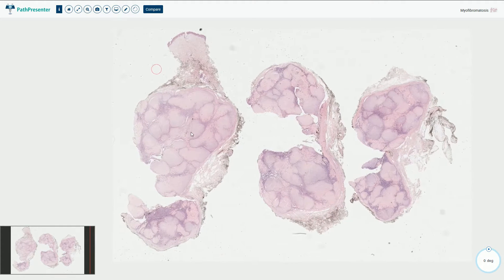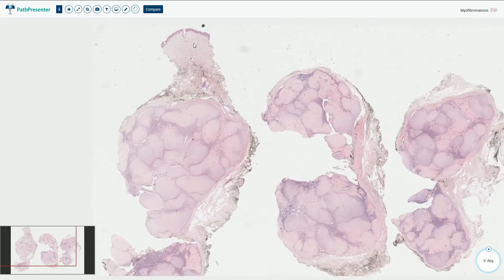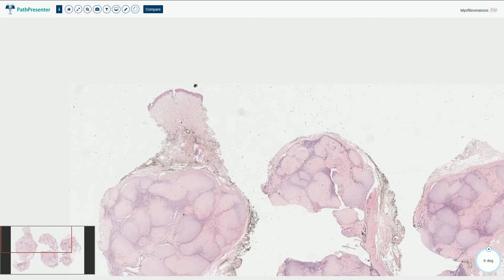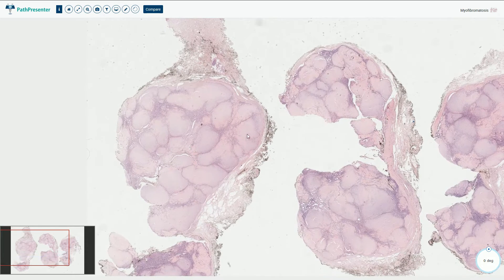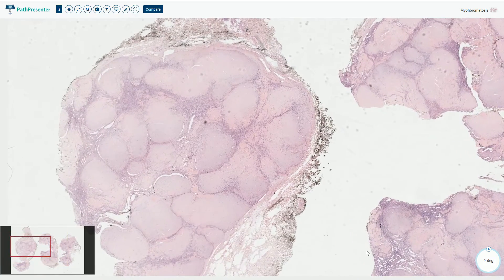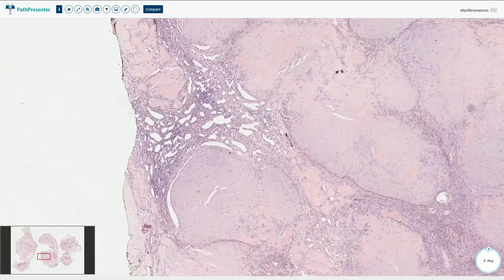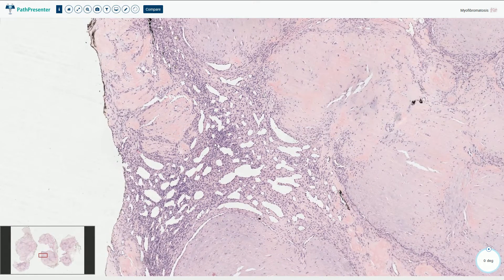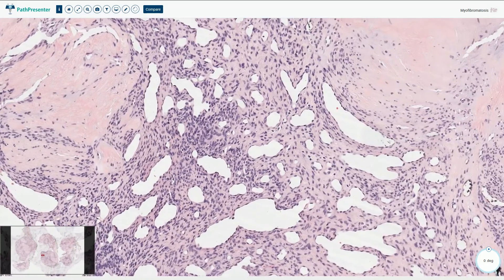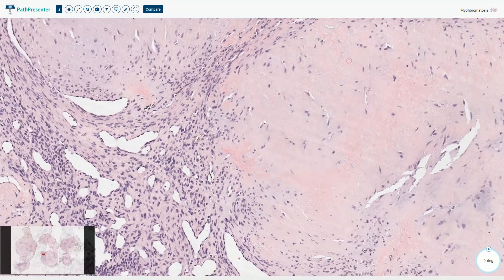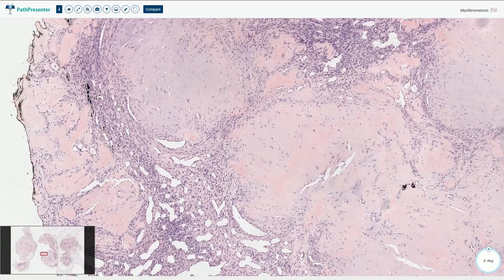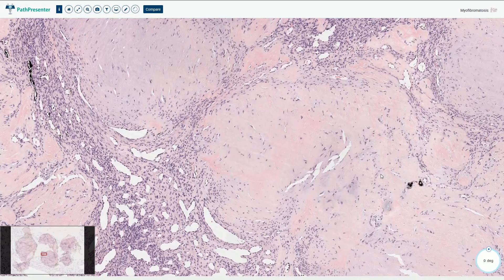This is another example of myofibroma showing similar morphology. Here we have the epidermis and a dermally located well-circumscribed lesion composed of myoid nodules and lobules, with the typical second more cellular hemangiopericytoma-like component. We see branching vessels, bland elongated cells, and hypocellular myoid nodules with a myxochondroid background.